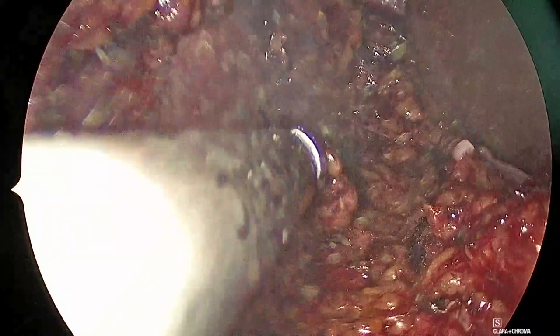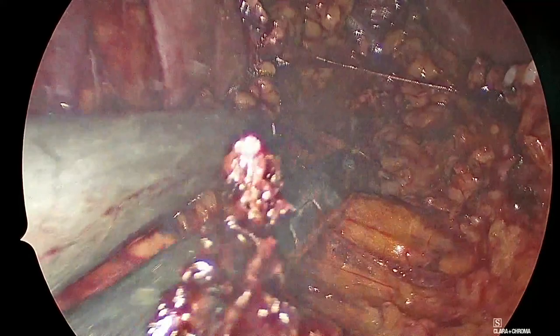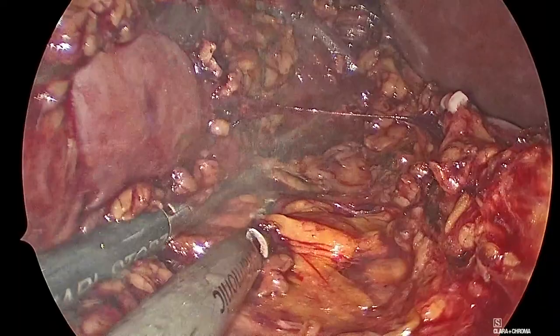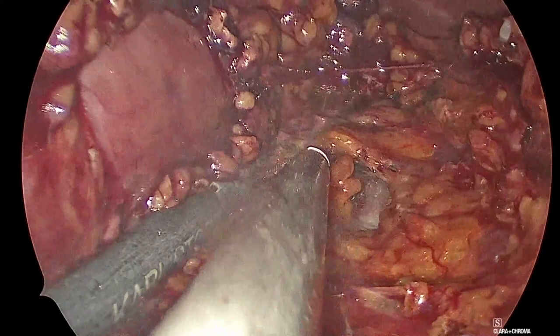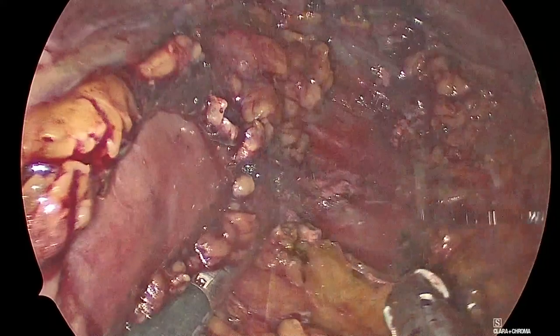See, the reason why I don't like very much the ultracision, not that I don't like it, I shouldn't say things like this, but the reason why it's not my favorite instruments is because of all of this foggy vision. And even if you try to open the ports or use the pump, maybe we can use the pump from Karl Storz and see if with the pedal we get less of this annoying vision. This doesn't happen with the other sealers.